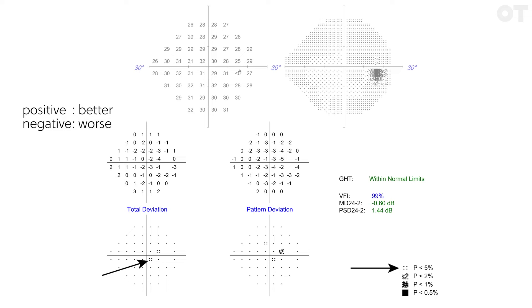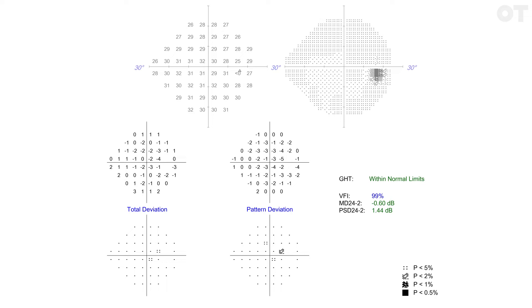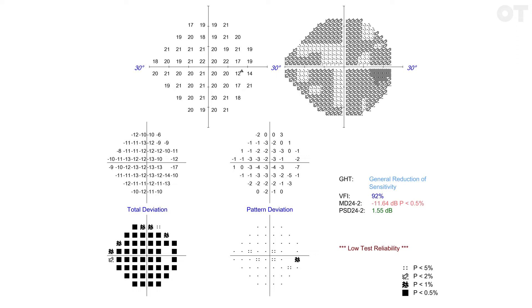Or to put it another way, 95% of normal patients of this age would have better sensitivity at this location. Is the patient's hill of vision lower than expected for their age group? A generalized depression on the total deviation plot can indicate cataract, small pupil size or uncorrected refractive error.